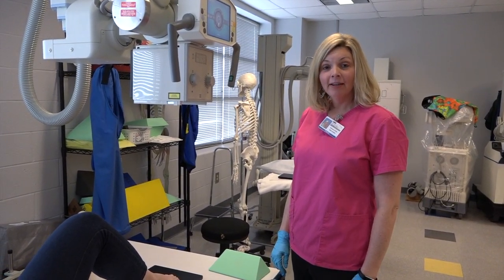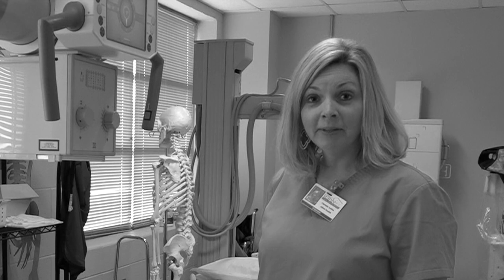Our next exam is going to be the foot. We'll go through the AP, the oblique, and the lateral foot.